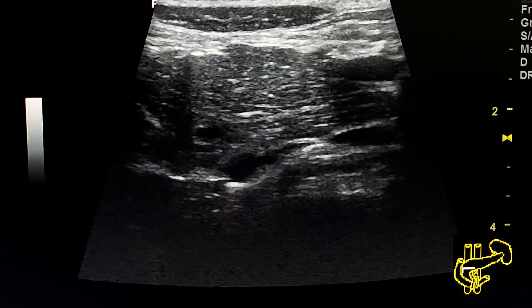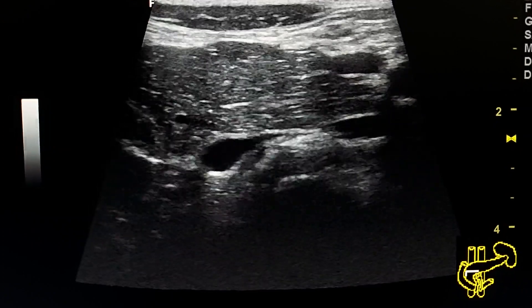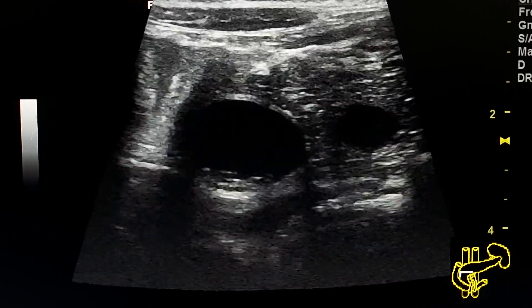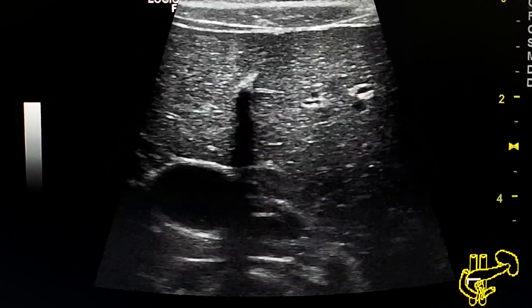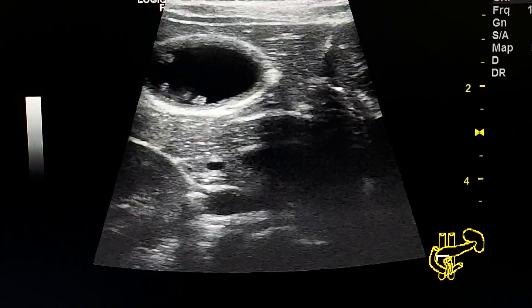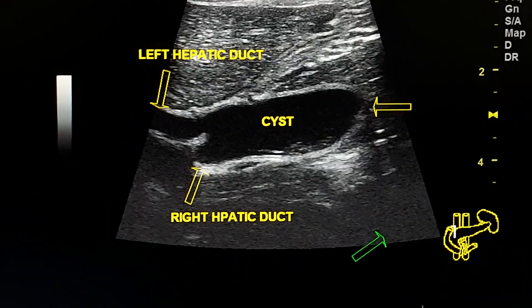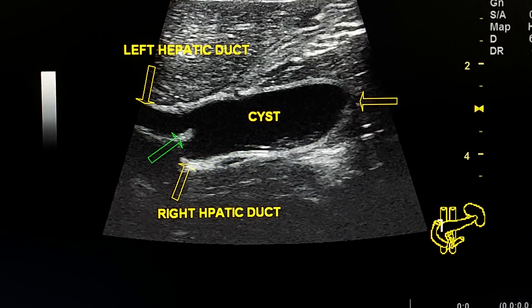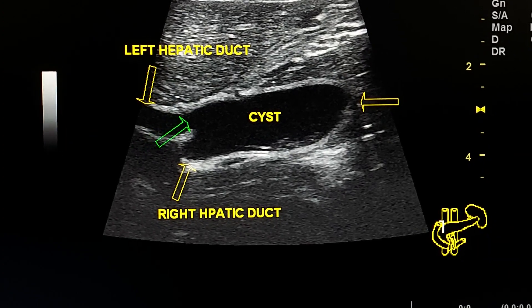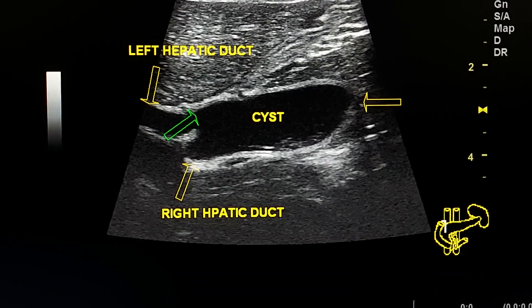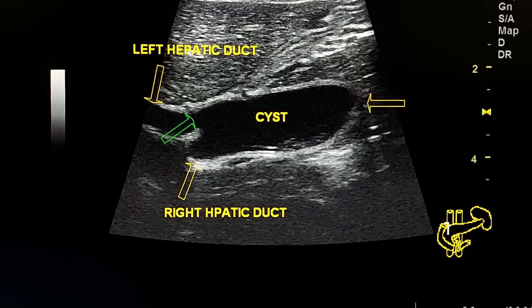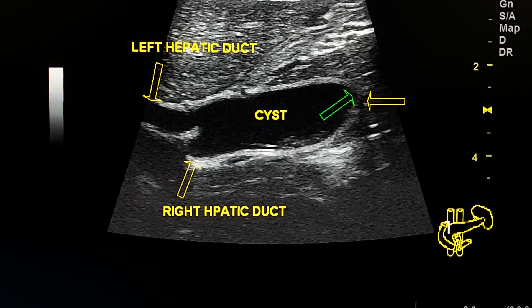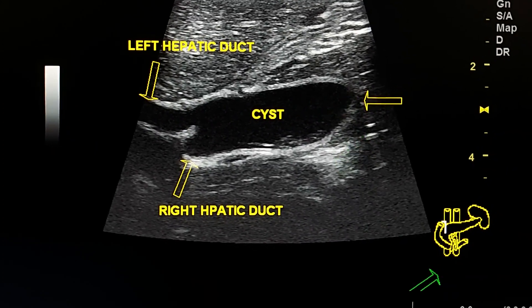Here in this view we see how the dilatation of the extrahepatic system ends here in the head of the pancreas. This is a long section of the choledochal cyst showing the dilatation from the confluence of the hepatic duct to the head of the pancreas.